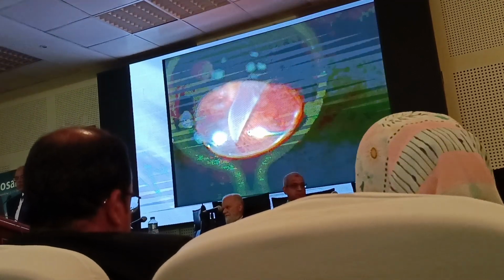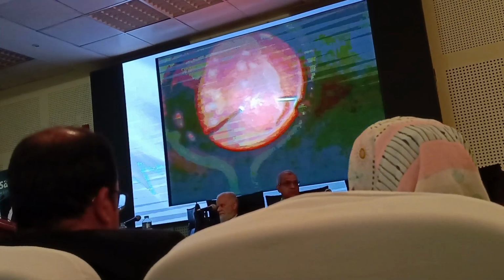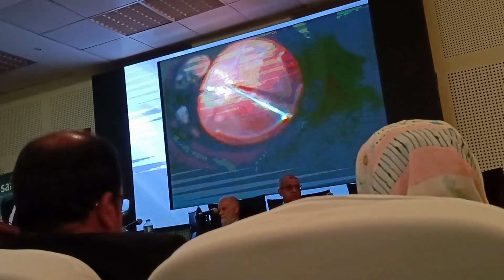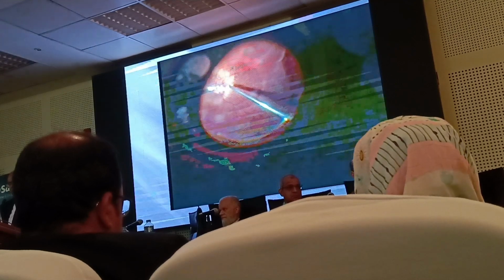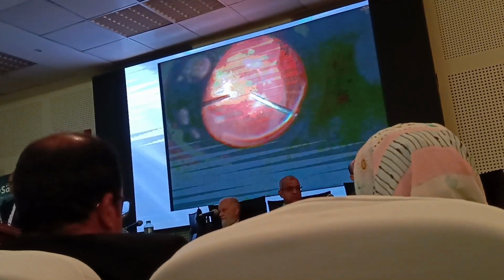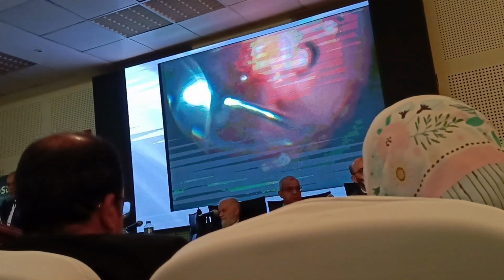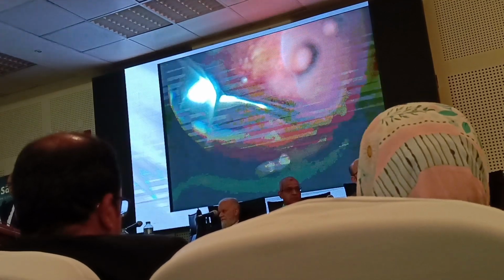The typical use of perfluorocarbon liquids is the giant retinal tear. Actually, starting to use perfluorocarbon liquids to reattach giant tears was a breakthrough in the management of this break. A giant tear now without PVR has one of the best prognoses in all vitreoretinal surgery, but you have to be careful.